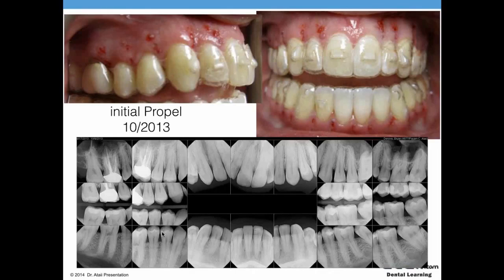And here's what the patient looked like. Just a 3-month follow-up, I was able to get at least close to it, where the laterals and the canines on 7 and 27 are just getting ready to touch. I intentionally took the aligners out so you can actually, doctors, see the posterior bite landing. So look at where he was before and look at where he is now. In 3 months' time, can we do that without some added help? And the answer is no.